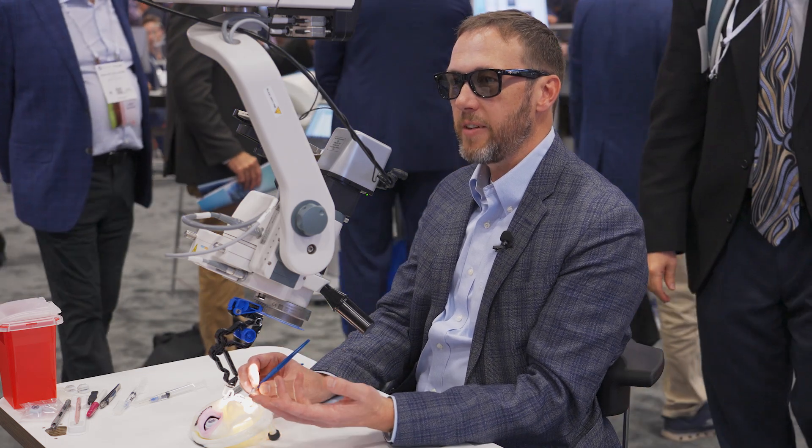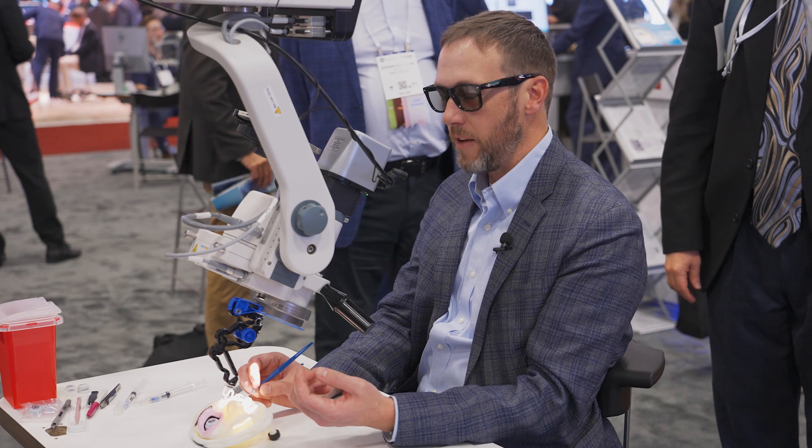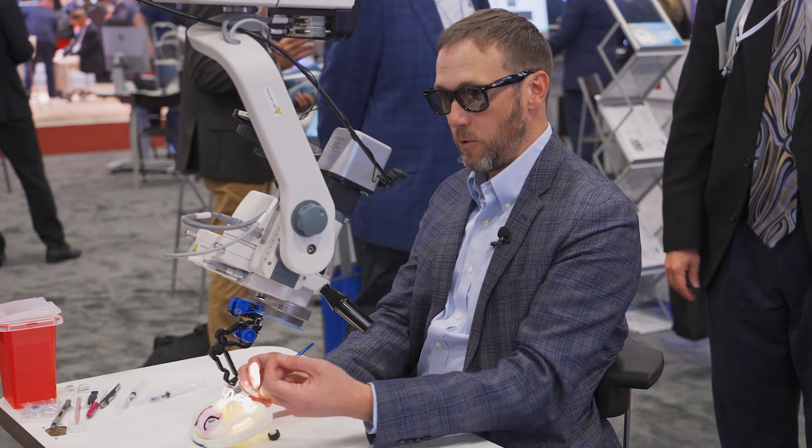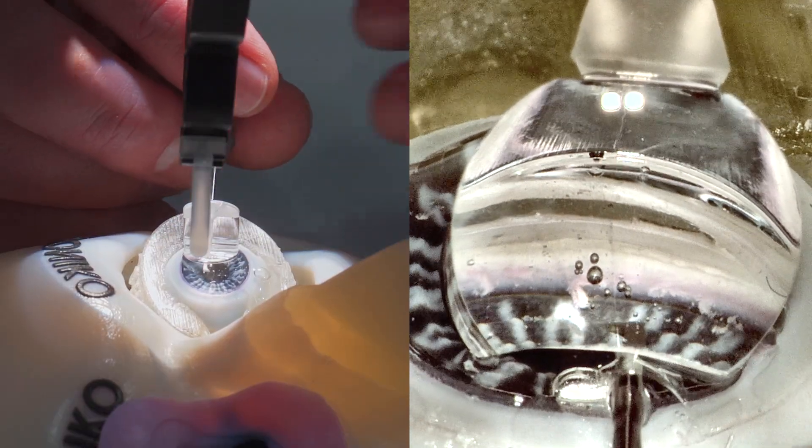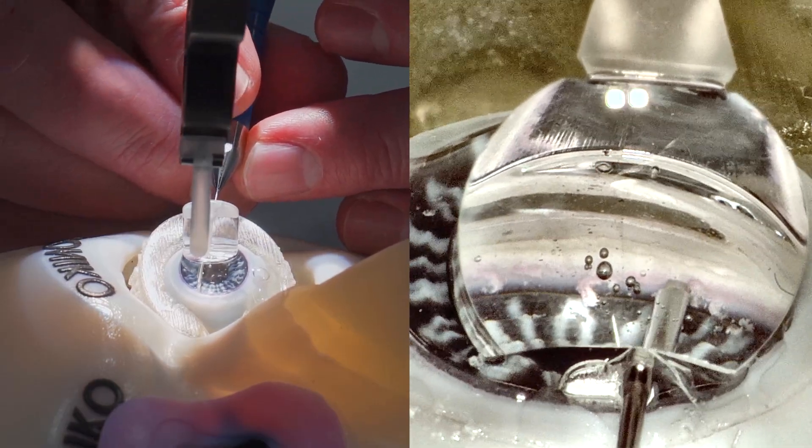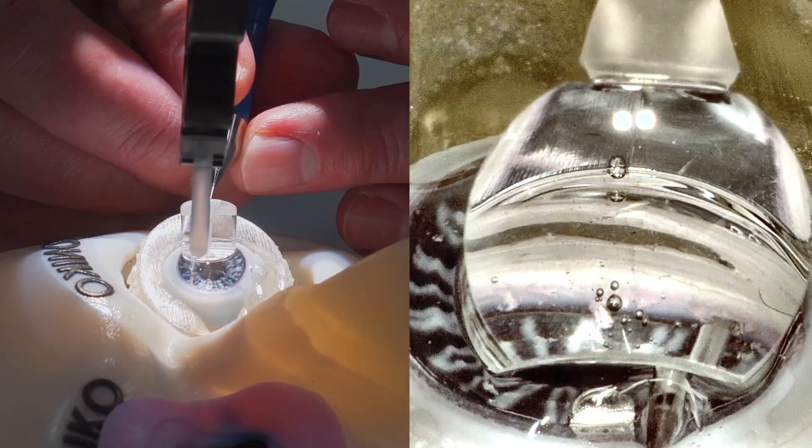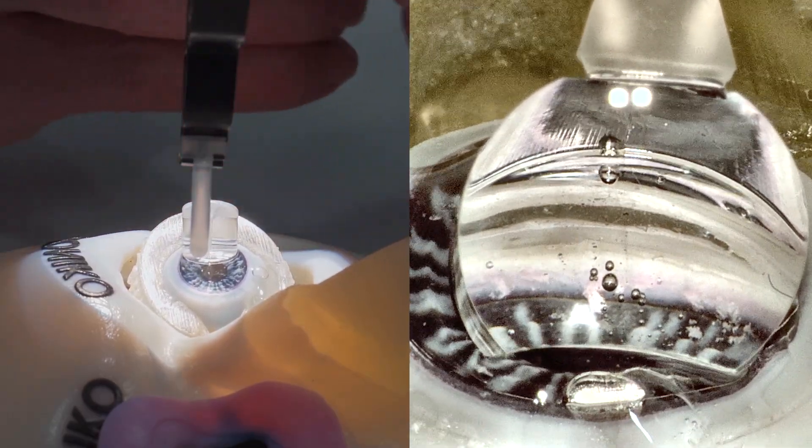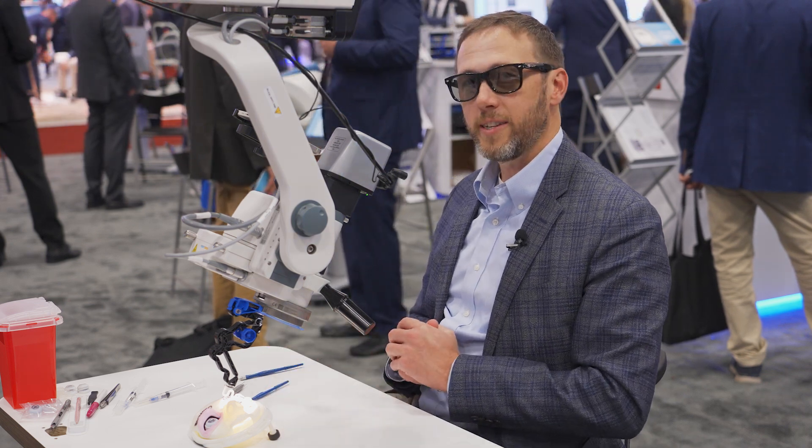The other thing is you can get a little bit of extra range if you want a wider goniotomy. Again, if you have a paracentesis wound, I can use a second instrument like a Sinskey and rotate the eye to the right or to the left to get even further treatment, which is just another great advantage. I think we'll continue to figure out ways to use our second hand as we get used to having two hands on your device. So that's the gonio ready. Thank you for listening.